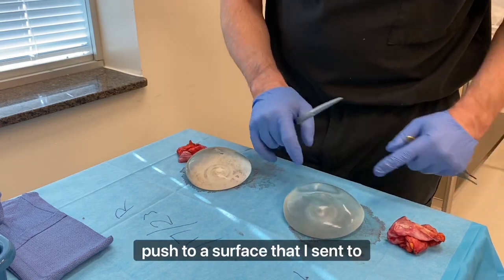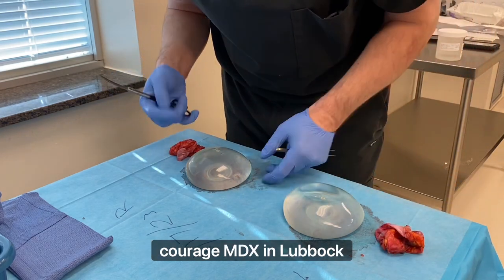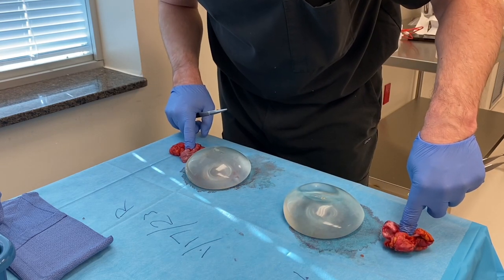I already took my biopsy off the posterior surface that I send to do DNA analysis through MicroGenDx in Lubbock, Texas, and we'll send the rest of this off to do pathology here in Austin. That's it.